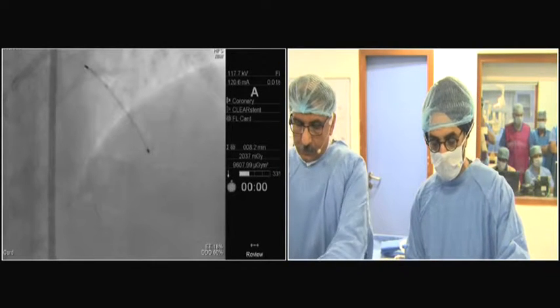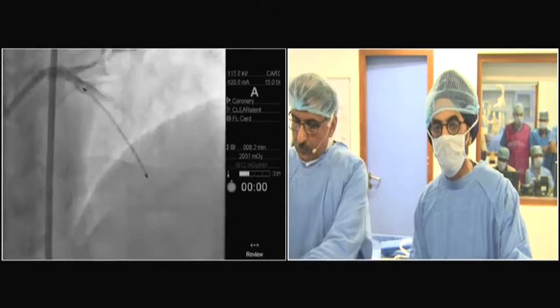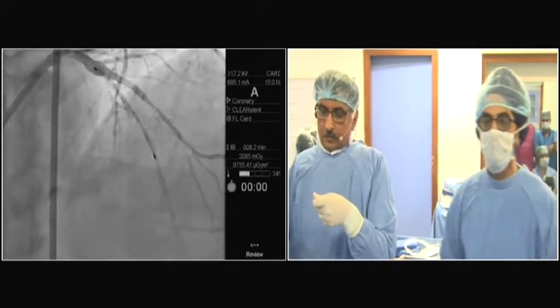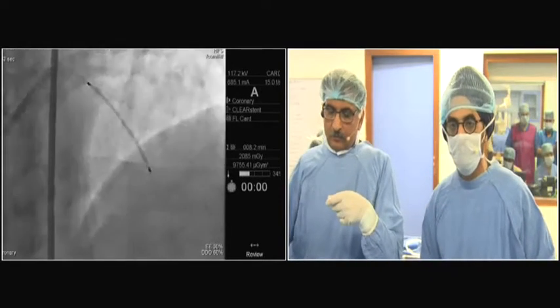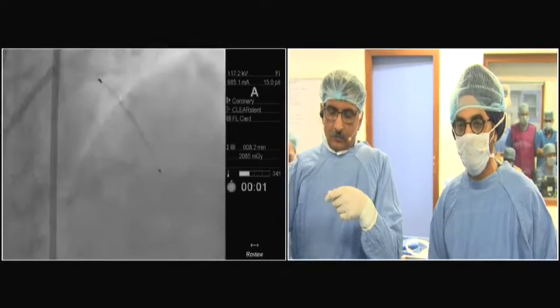David, what's your suggestion for the patient? 1 stent or 2 stent technique? Well, I'm going to be giving a talk in a minute, so I'm going to keep my powder dry.